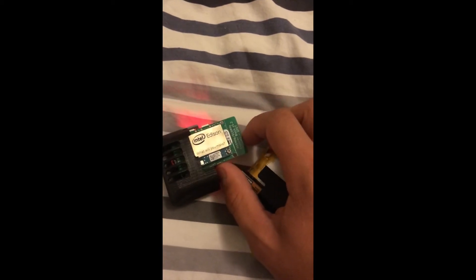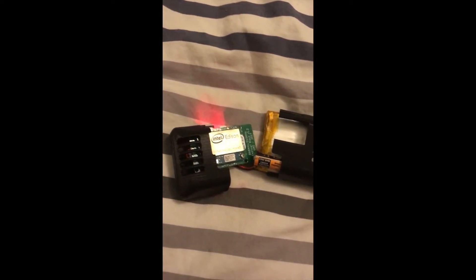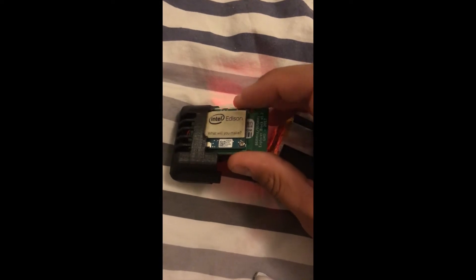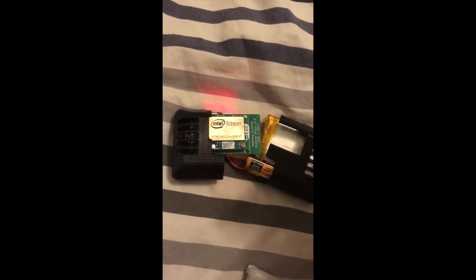So how the device works is it's constantly getting information about what your blood sugar is, because your blood sugars are on the internet — and your blood sugars are on the internet because they're being read by your Dexcom. You can use a G5 or a G4, but in a nutshell this thing is getting your blood glucose information, running it through an algorithm, and then making a prediction about what your blood sugar is going to be.